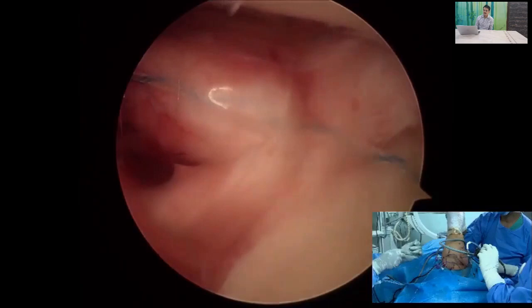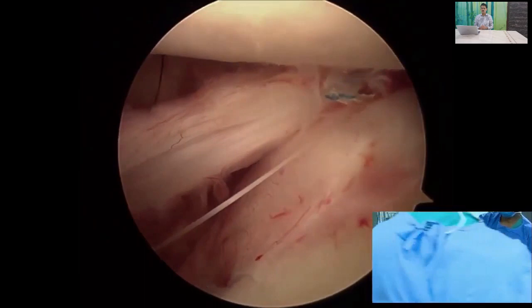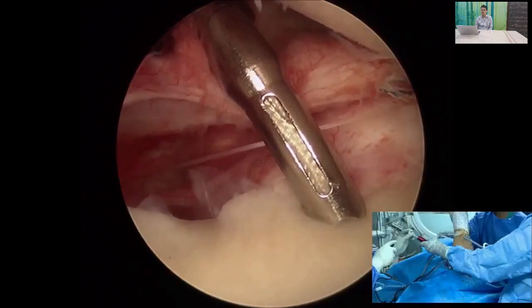Once the first knot is passed inside, it gives significant stability to the shoulder. The shoulder is stabilized with a single knot. The structure visible at the top is the anterior glenohumeral ligament. This one knot stabilizes the joint and the humeral head is reduced to its normal position.